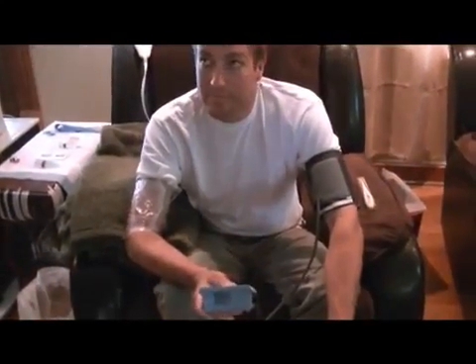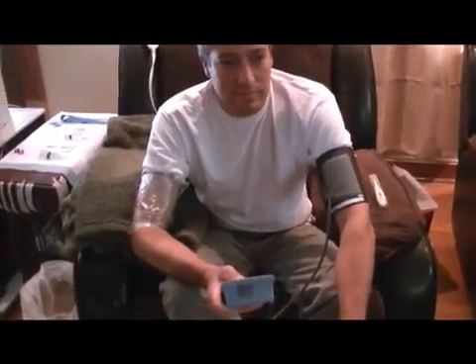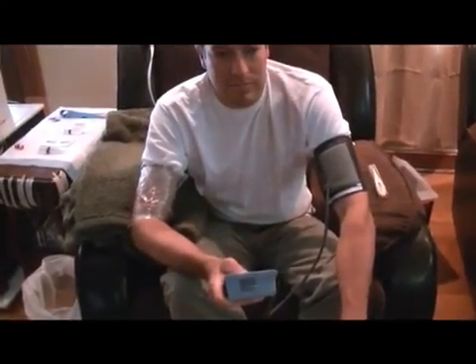Before we start the dialysis, he has to do a sitting blood pressure and a standing blood pressure, his temperature, and his weight. And then we record everything on here. We have to put the sitting, standing, everything, his post weight.